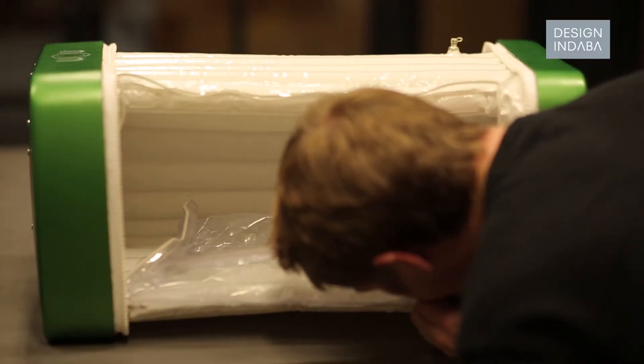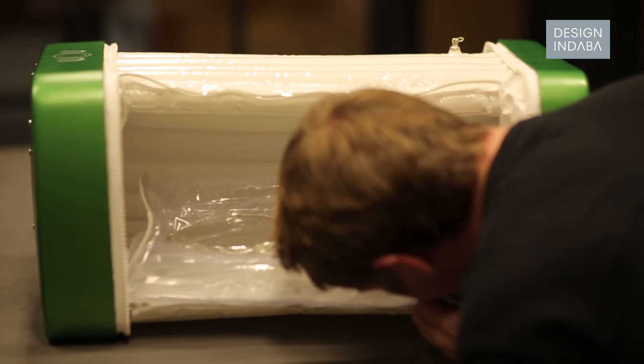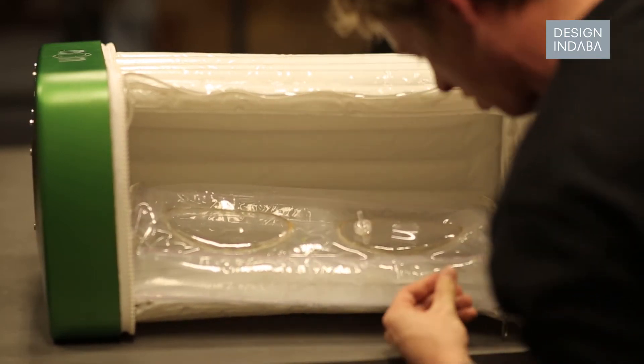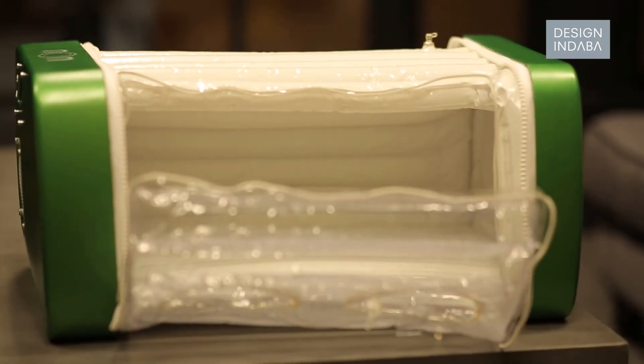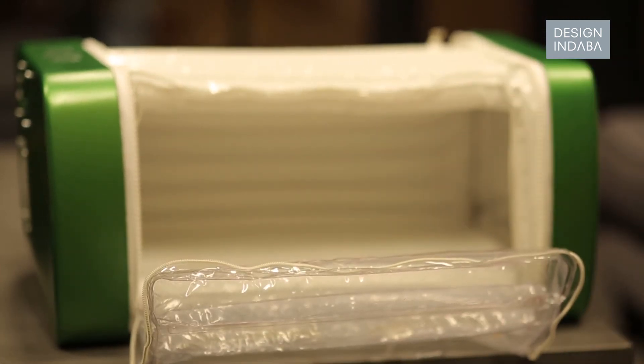The midwife or nurse on duty would inflate it when it's needed, and it becomes the size of a regular incubator. It just gives the most basic functions of what a child would need. It's not meant to be a hundred-thousand-pound incubator — it's just meant to give the absolute necessities that are actually missing in a lot of countries nowadays. That shouldn't really be happening, to be honest.